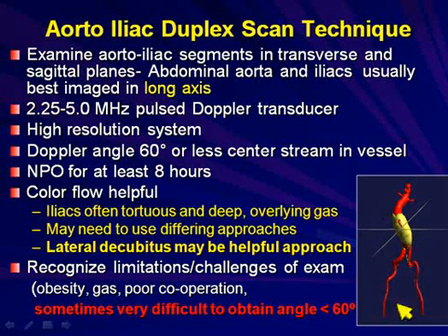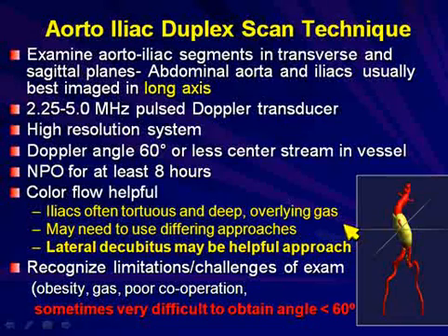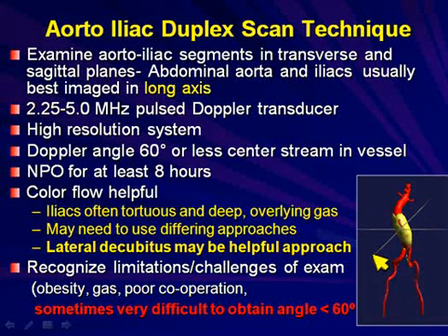This picture is a 3D reconstruction of a 1 millimeter CT, and you can see here that this is quite an angulated aorta, and you can also see how tortuous these iliac arteries are. And even though a standard axial CT would drop the plane this direction, we're able to put a plane in these CT scans in an orthogonal or perpendicular approach, and that's what we do with ultrasound to be able to accurately measure the residual diameter here.